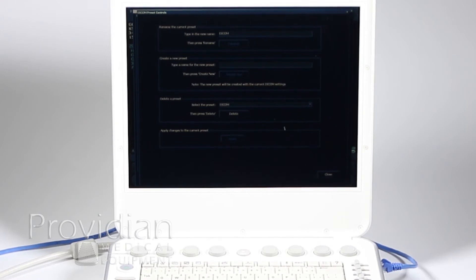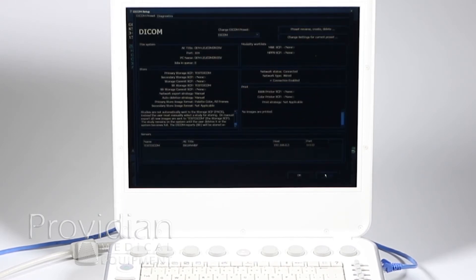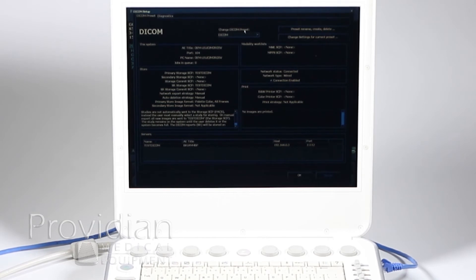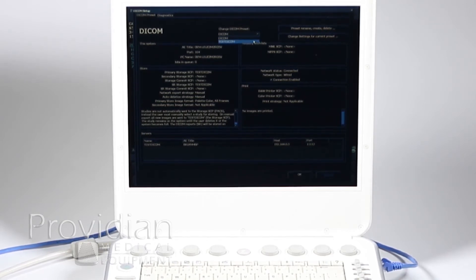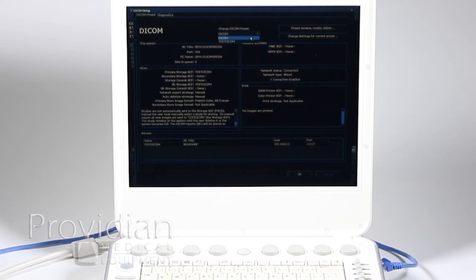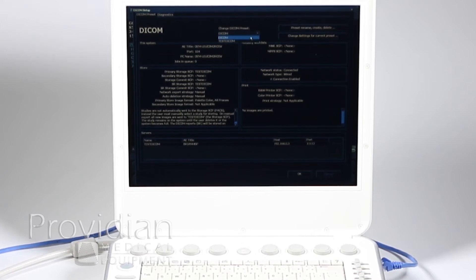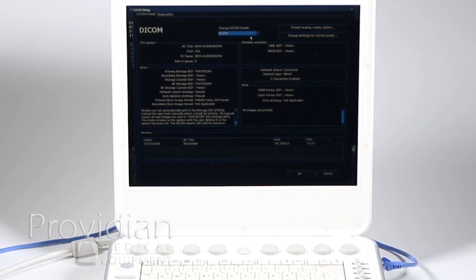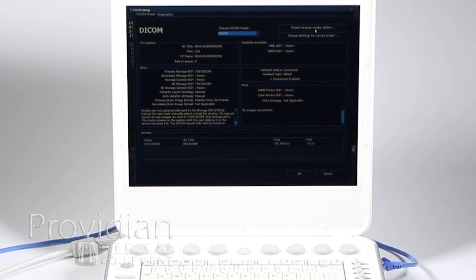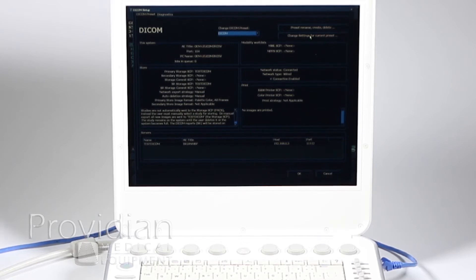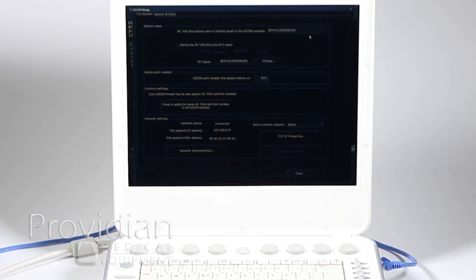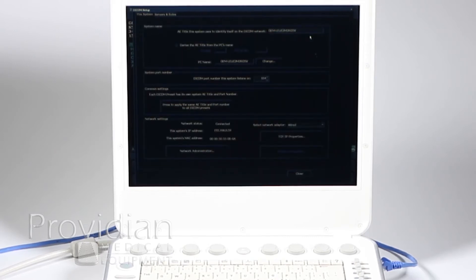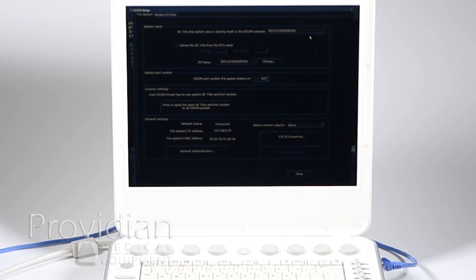We'll go ahead and hit close. So now I've got two DICOM presets, the previous one where I did some testing on it, and this current one where I'm just going to select the DICOM. I don't want to rename, create, or delete anymore. Now I want to change the settings for this current preset.